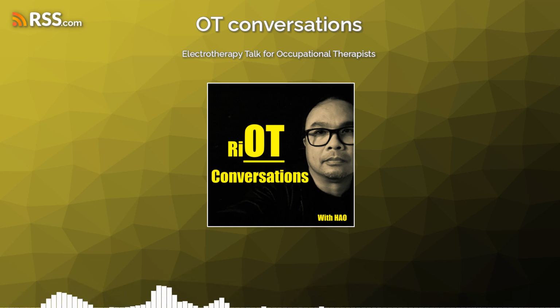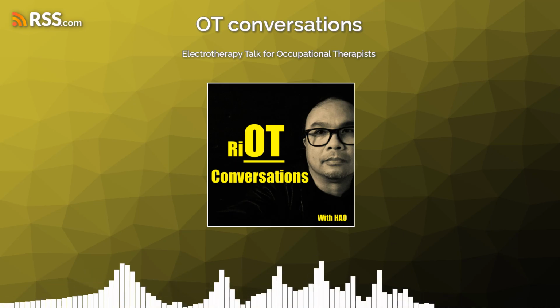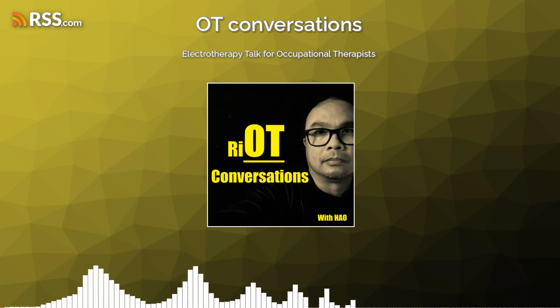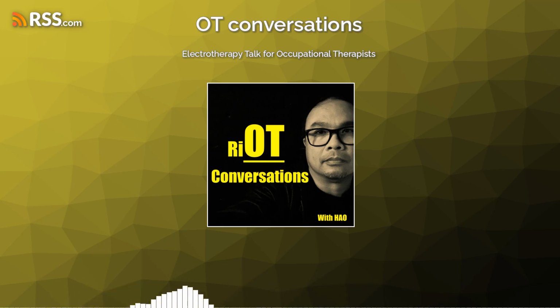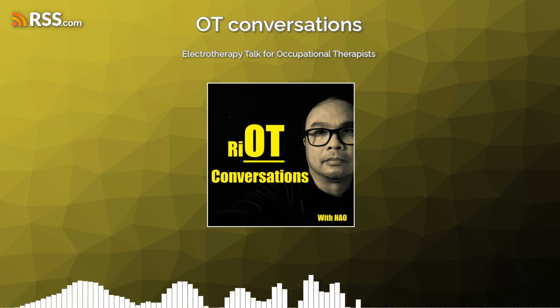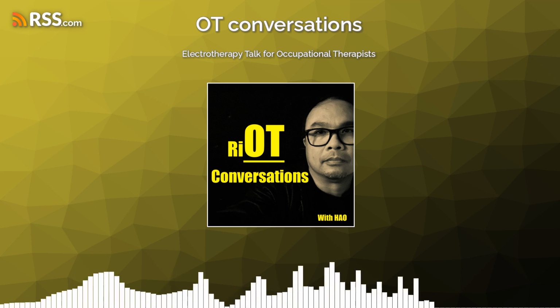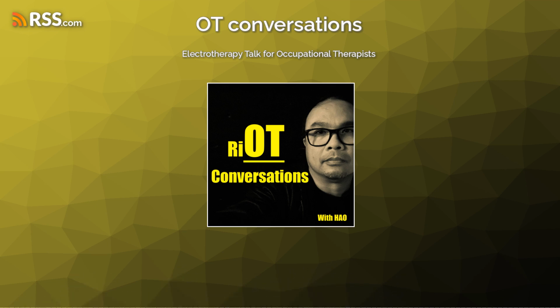What are the good things about electrotherapy? One, it is non-invasive. So you don't need to inject it, just in the superficial part of the body, down in the skin. It promotes healing because when you're exercising and you're moving the muscles, you're facilitating the blood flow, and blood will deliver all of those antibodies, all of those repair mechanisms, platelets, things like that. So it promotes healing because of the blood flow increase.